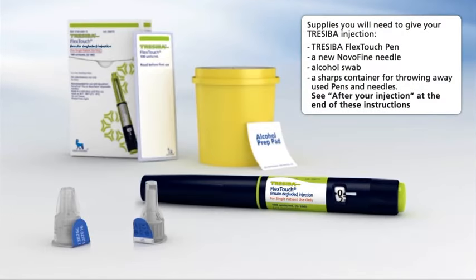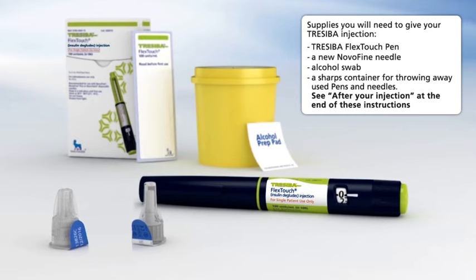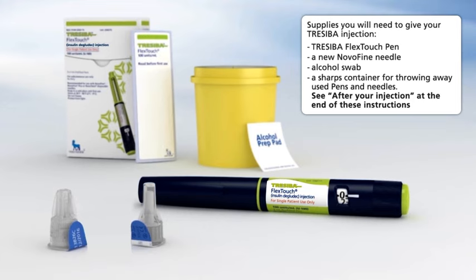To give your Traceeba injection, you will need the following supplies: a Traceeba FlexTouch Pen, a new NovoFine Needle, an alcohol swab, and a sharps container for throwing away used pens and needles. See 'After Your Injection' at the end of these instructions.